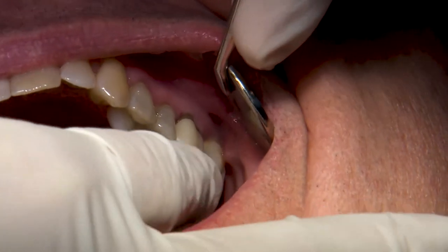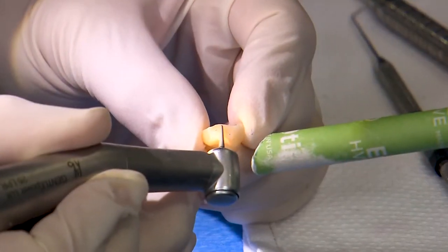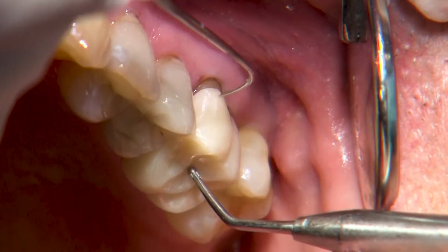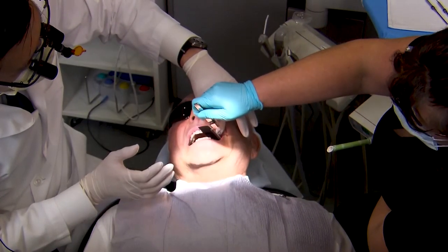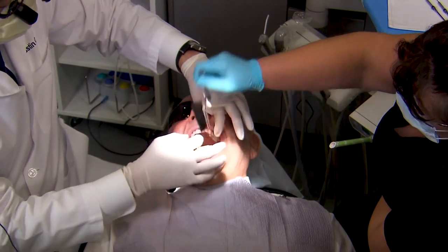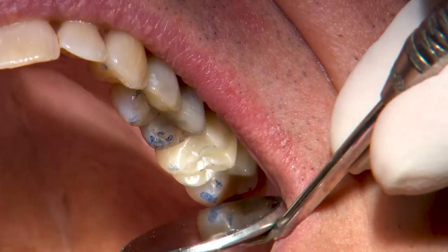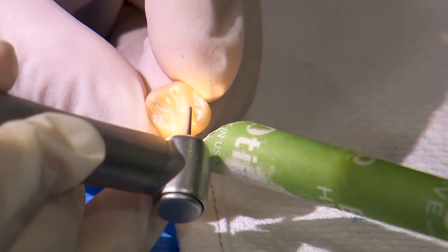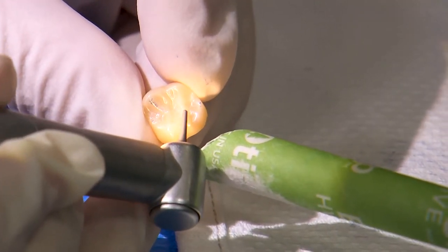At this point, I'll seat the crown and check the proximal contacts. Since I've found a contact value on the software that works for me, I normally have very little to no need to make adjustments to these areas. After evaluating the margins with an explorer and a bitewing radiograph, I'll check the bite for any heavy contacts. When making adjustments to lab or chairside Bruxer, we recommend using fine grit diamonds to limit the amount of surface roughness. Following any adjustments, polishing the restoration is recommended to ensure the adjusted surfaces are as smooth as possible.